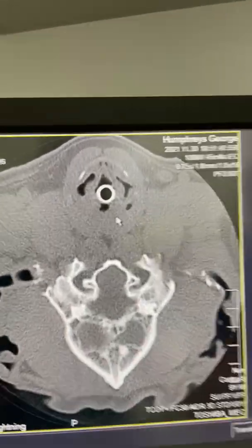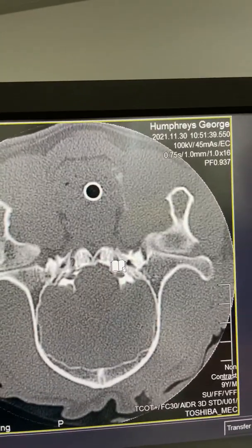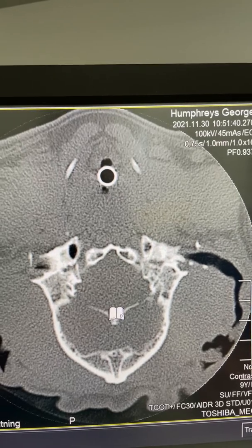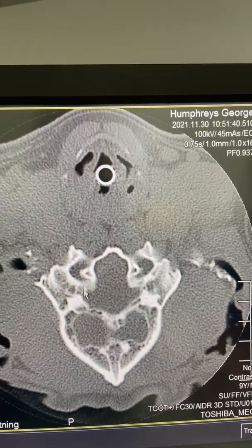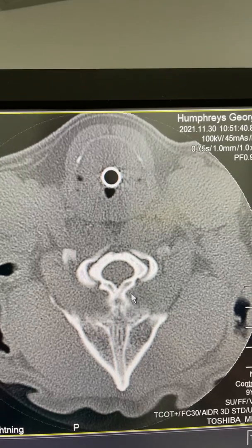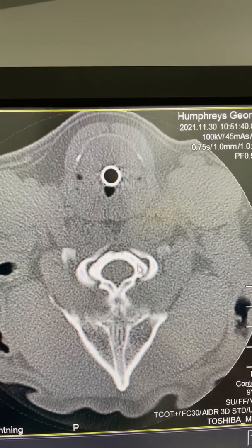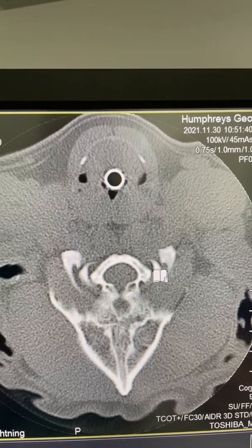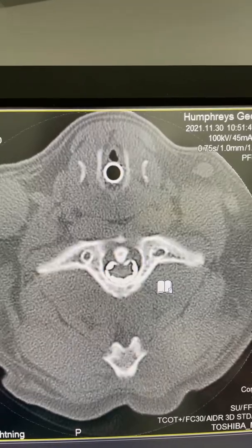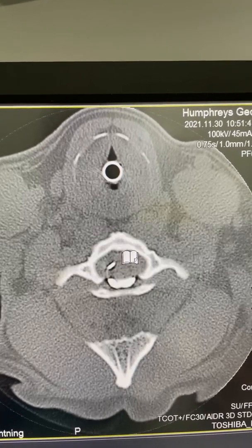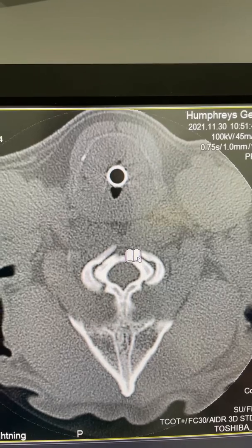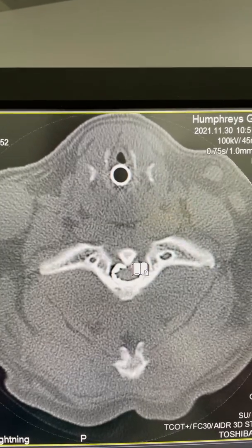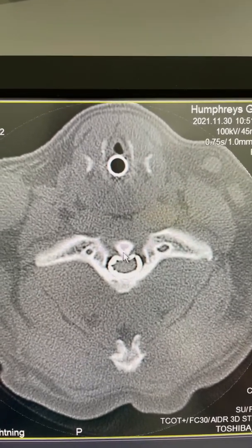This is the brain coming in, so that's the tentorium cerebelli right there, and this is where the cerebellum would be. Heading cranially, this is the skull, this is C1 back here. As we head cranially we can start seeing myelographic contrast starting just at the brainstem or just at the foramen magnum, which is ideal — meaning we're less likely to have seizure activity. This is the dens sitting right here.